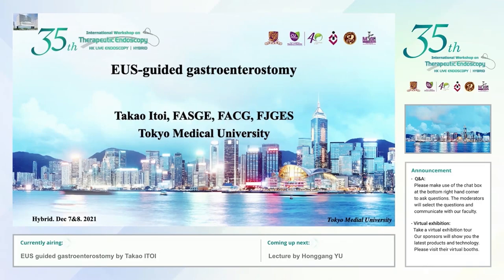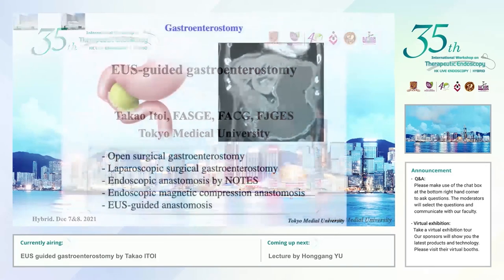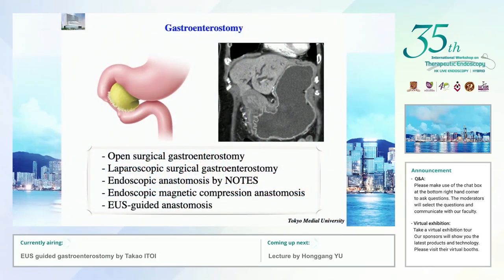In this lecture, I'd like to talk on EUS-guided gastroenterostomy. As you can see on the slide, nowadays there are several therapies of gastroenterostomy. Of these therapies, recently EUS-guided gastrojejunostomy, gastroenterostomy is emerging.